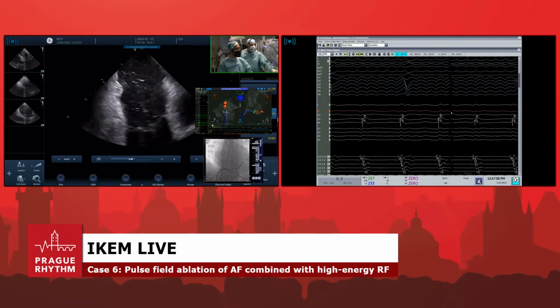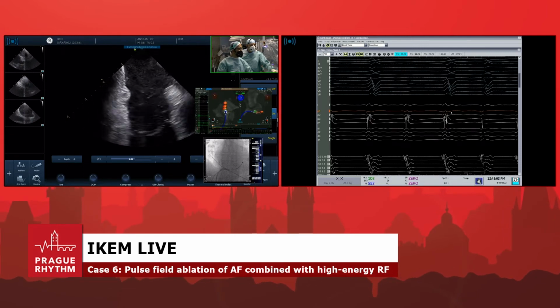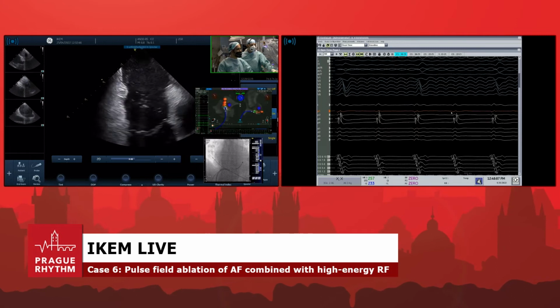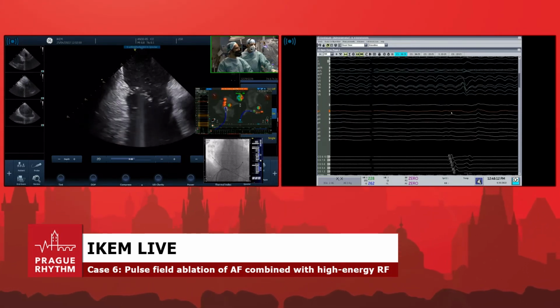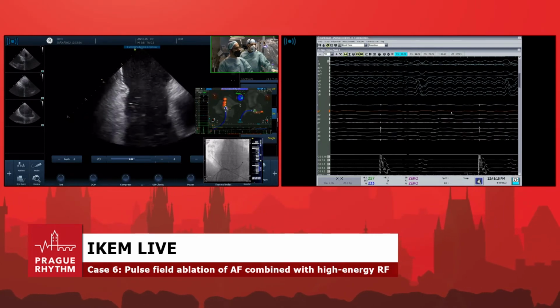Okay. So we are more or less in the middle of the isthmus now. In the middle of this relatively lengthy isthmus. IVC would be here, so it's another 1 or 2 applications, I believe. Okay, finished. Can we pace? You see the tachycardia is already gone, terminated. It doesn't mean that there is block. But block, oh, it is.